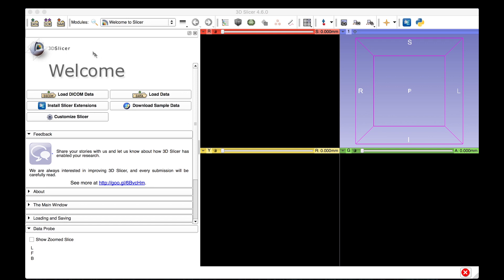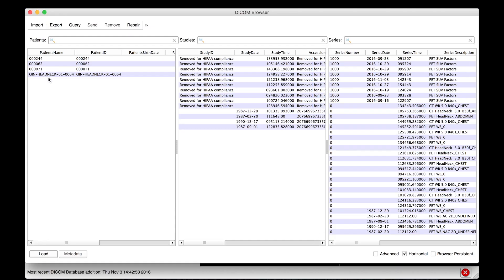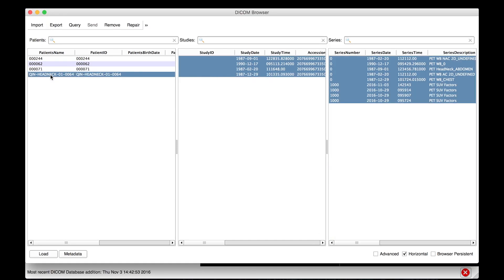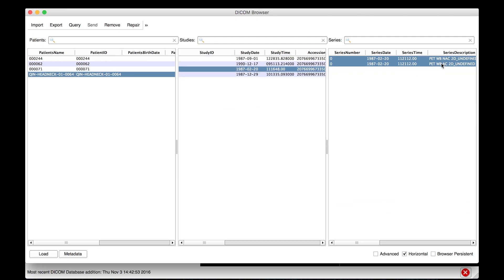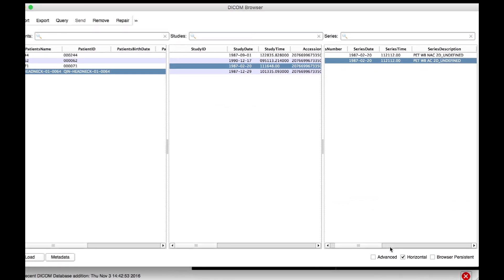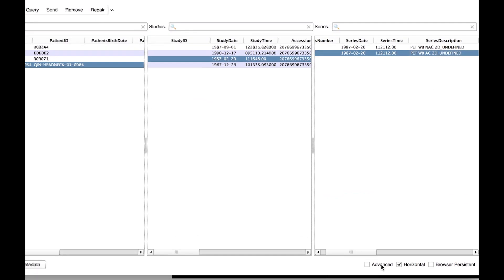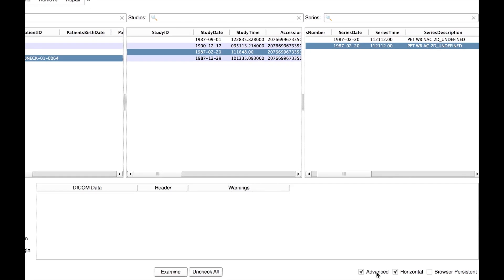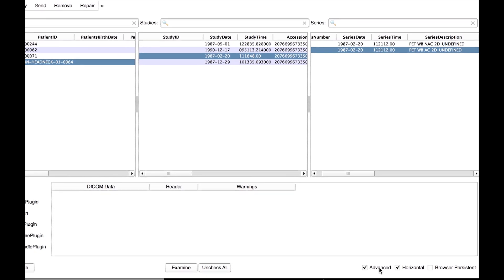To load a PET scan as an SUV normalized dataset, open Slicer's DICOM browser and select the PET scan you wish to load. Under the Advanced tab, make sure that the PET-SUV plugin is enabled.